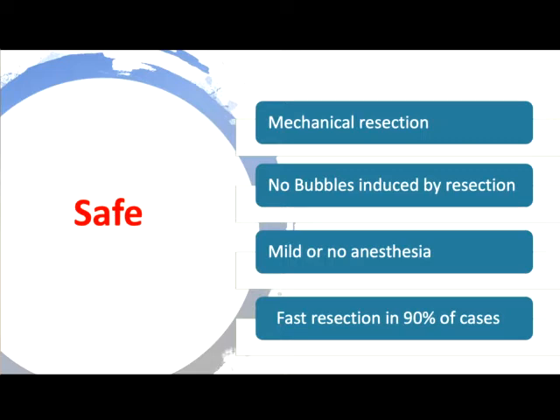I've been trained with the resection, so I know what resection means. I'm not saying that I made the shaver because I'm not able to use the resection. This is wrong. I've been trained with the resection. Me and Rudy Campo, we did many courses all around Europe to train people to use the resectoscope. So we know exactly how a resectoscope is. So first of all, it's safe because it's a mechanical resection.